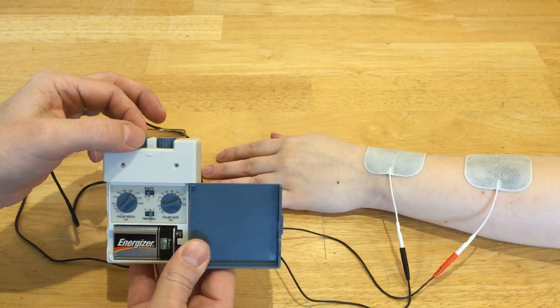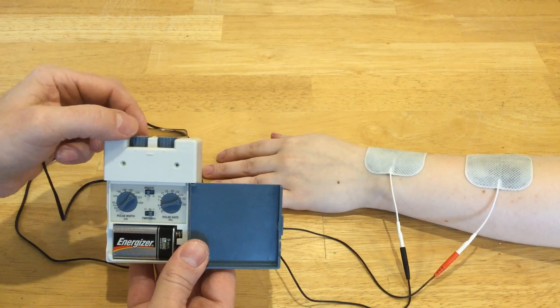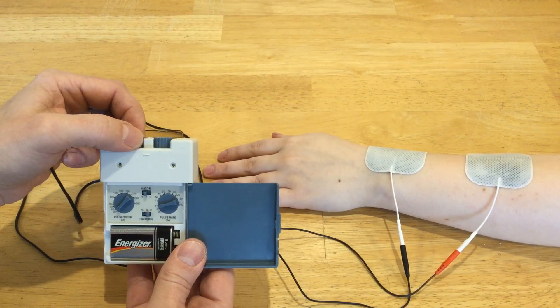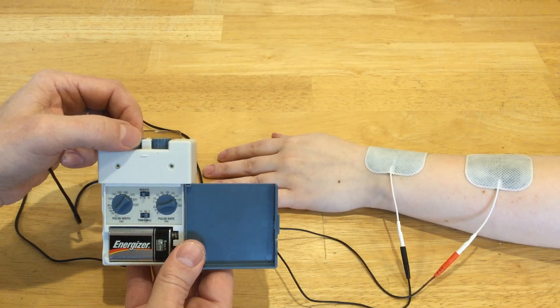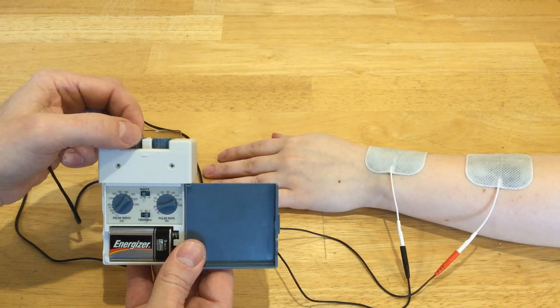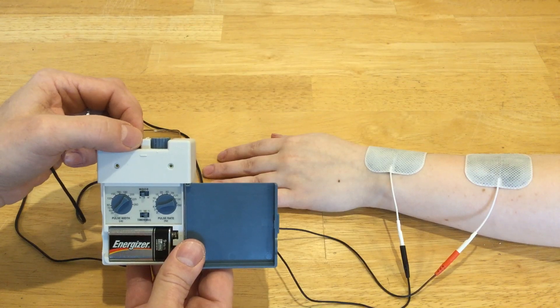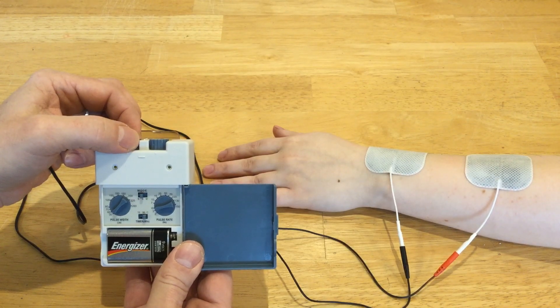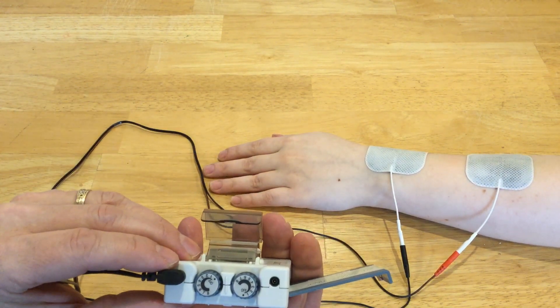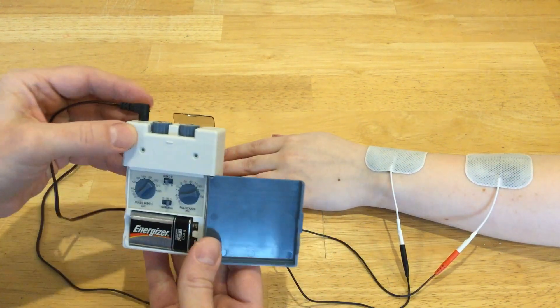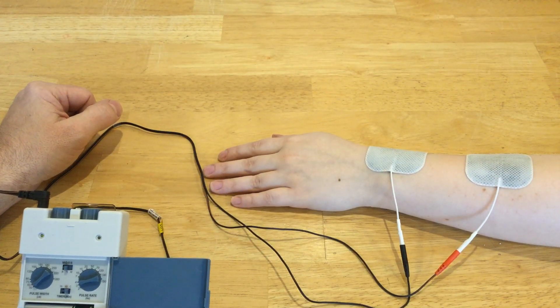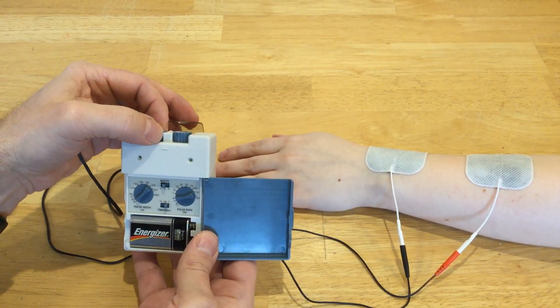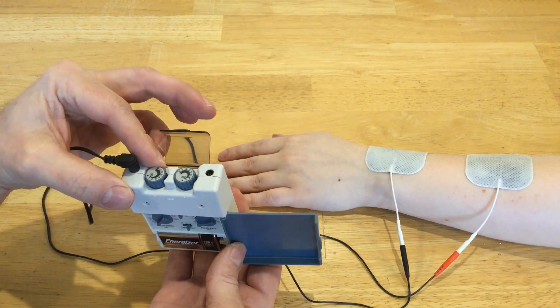Okay. So at this point, my client feels it. And what does it feel like? Like a pulsing tingling. And is it mild or intense? Mild. So I'm going to turn up this a little bit more. Let me know when you need me to stop. How's that feel? Fine. Getting stronger? Yeah. How's it feel? Good. Getting stronger? Yeah. Now you can see at this point, I have it turned up as far as it will possibly go. The intensity is turned up as high as it can go. And still we have no motor response. That's because my pulse duration or pulse width is set very low, and we can't hit the strength duration curve for a motor response at that point.